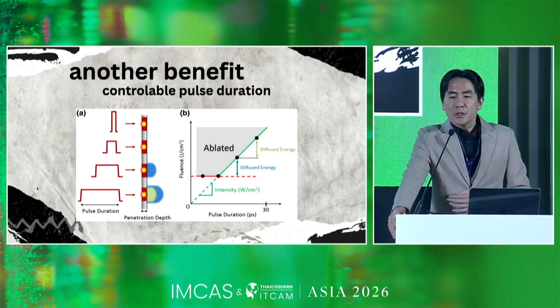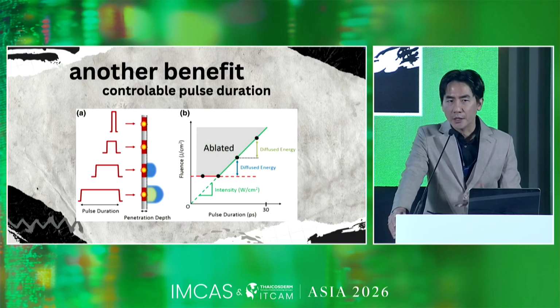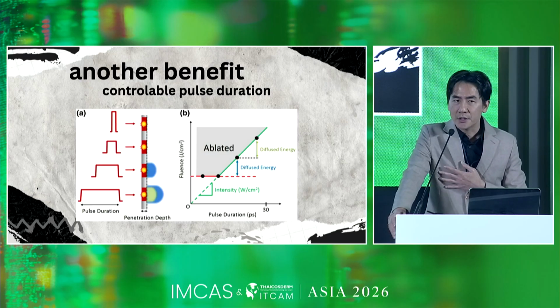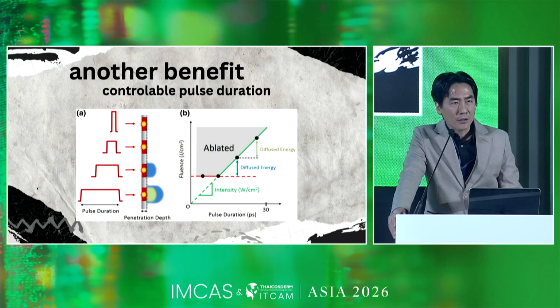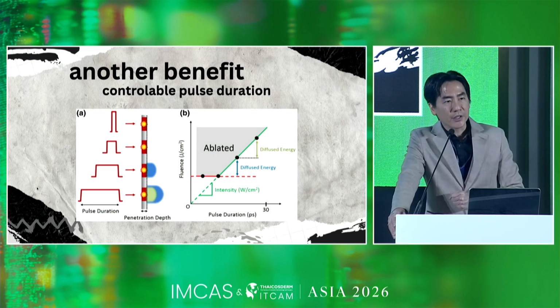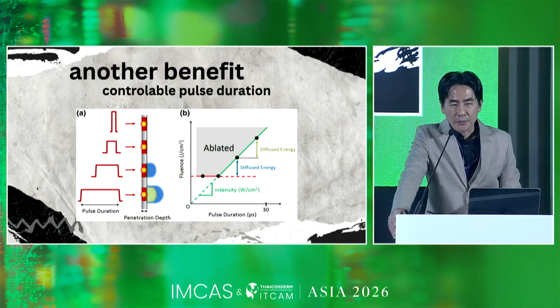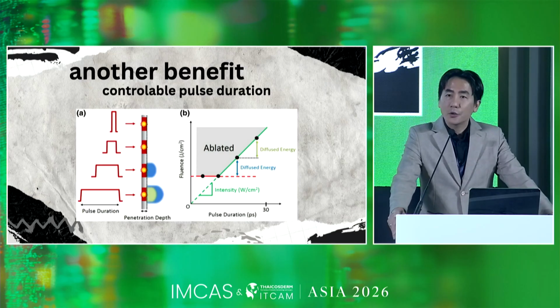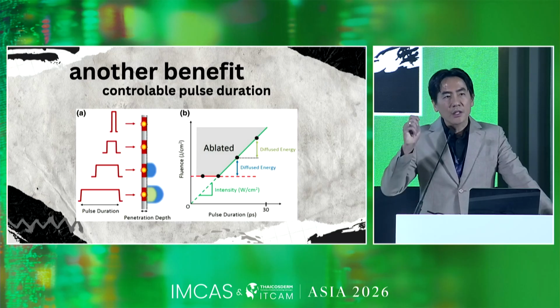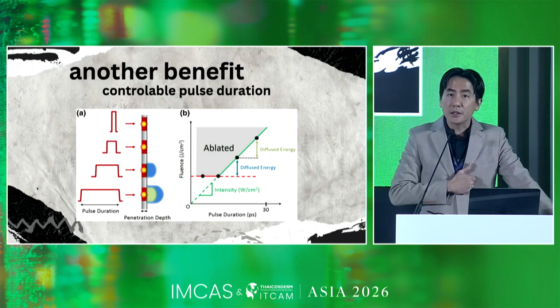But with the thulium, since the pulse duration is not locked and is open, we can modify it to our preference. We can create a very short pulse or a very long pulse. We can create total photomechanical ablation, or total photostimulation, just by adjusting the pulse duration itself. So for me, it's the best laser because we can adjust the depth, targeting a superficial layer or deeper layers.